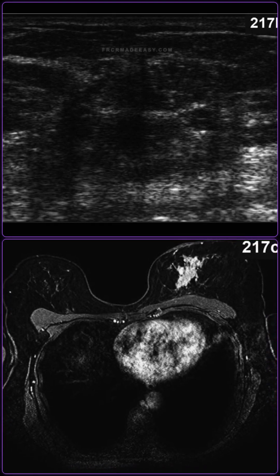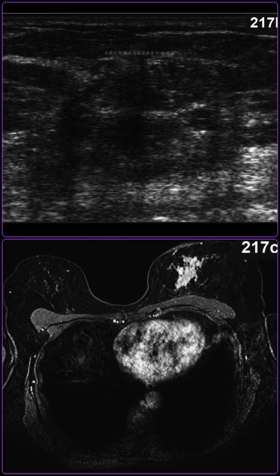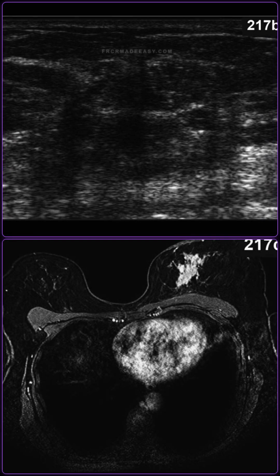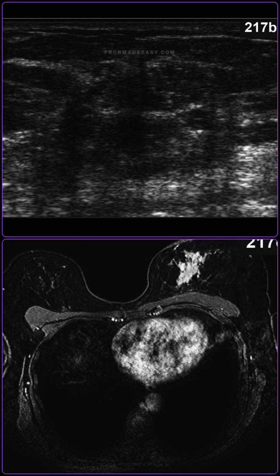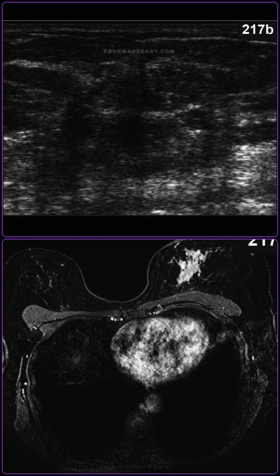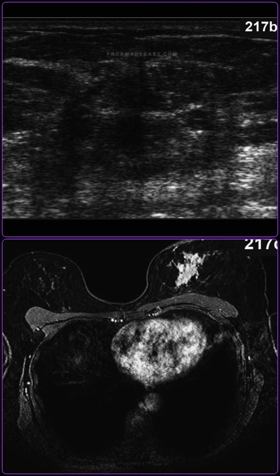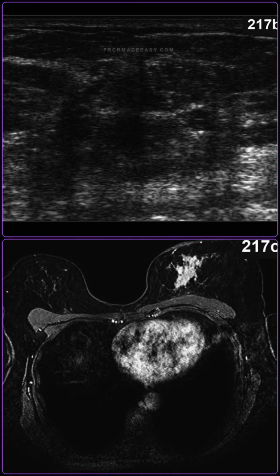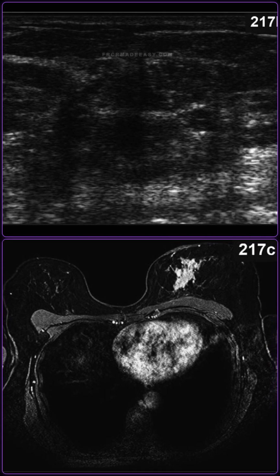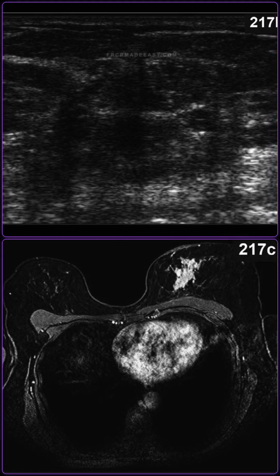Explain why invasive lobular carcinoma is difficult to detect mammographically and discuss the specific role of breast MRI in its staging. Okay. Invasive lobular carcinoma grows in an insidious single-file cellular infiltration pattern. Because it does not evoke a strong desmoplastic reaction or destroy the underlying tissue architecture, it often fails to form a discrete, dense mammographic mass. Instead, it frequently presents only as subtle architectural distortion or focal asymmetry, often seen only on a single view.